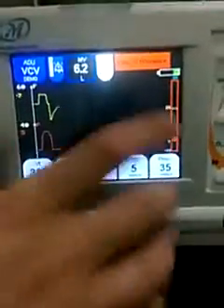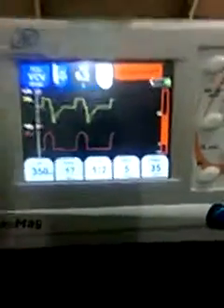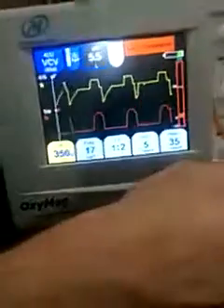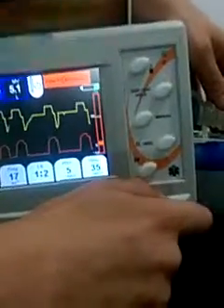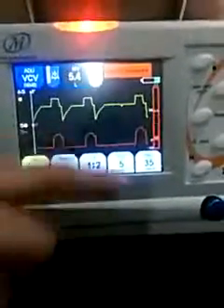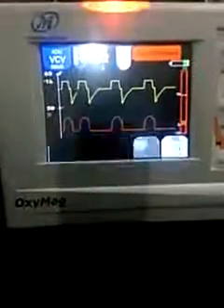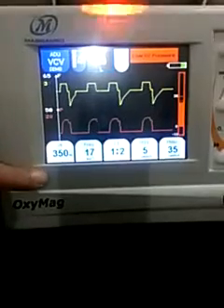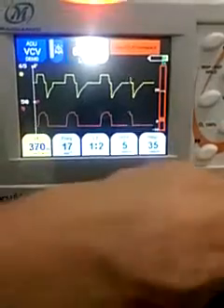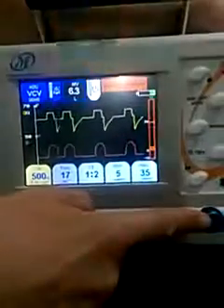Here you have the parameters that are adjusted automatically. Of course, if you want to increase, decrease, or change anything, it is possible for users. For example, I want to increase the tidal volume to 500 milliliters per inspiration. When you increase or decrease anything, you should confirm before changing another parameter. Like right now, we didn't confirm, so the equipment will go back to the first set. Now, for example, increase. You can confirm by touching the screen or the knob.